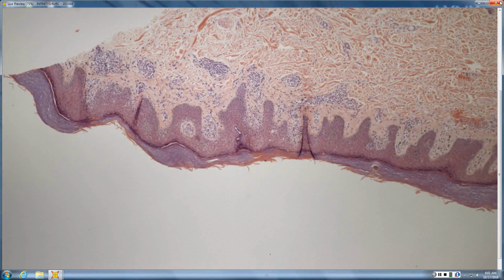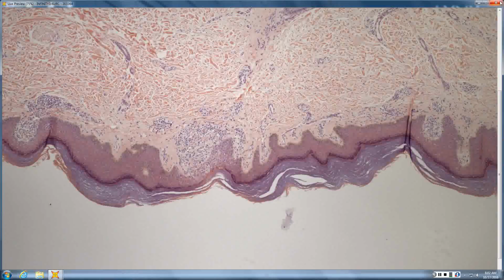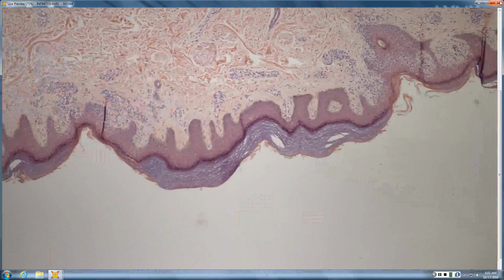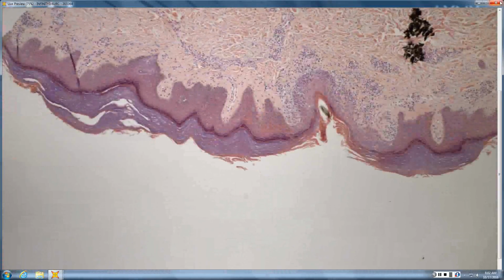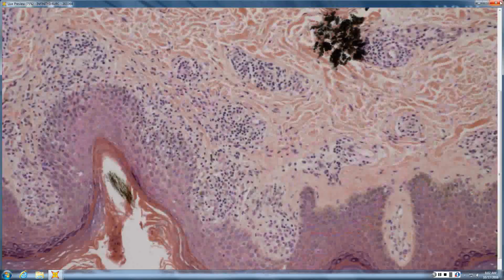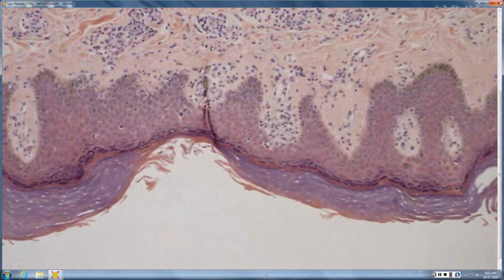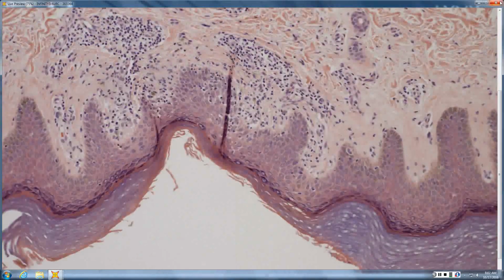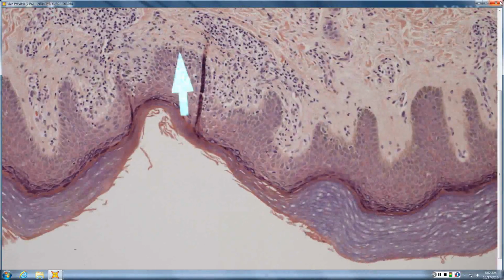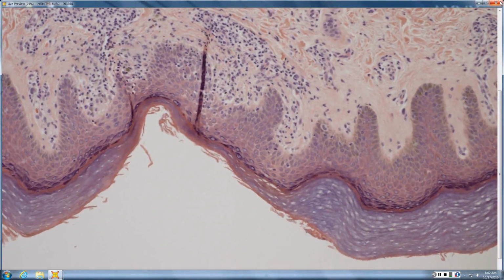There's some superficial inflammation, and kind of pretty regular acanthosis of the epidermis. It looks like there are lymphocytes with some vacuolar change. And the pattern, is it holes out of proportion to lymphs, or is it more like a lymph in every hole? I would call it a lymph in every hole. So lymph in every hole pattern, what's your differential?